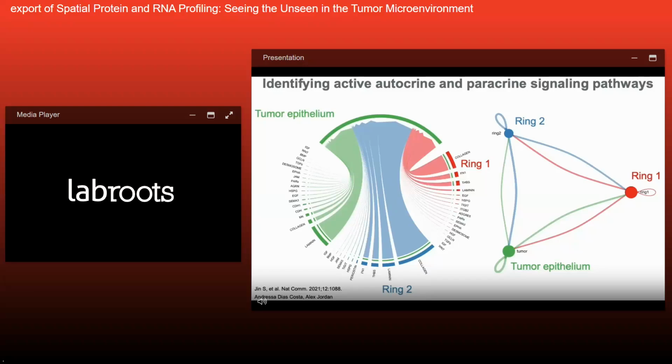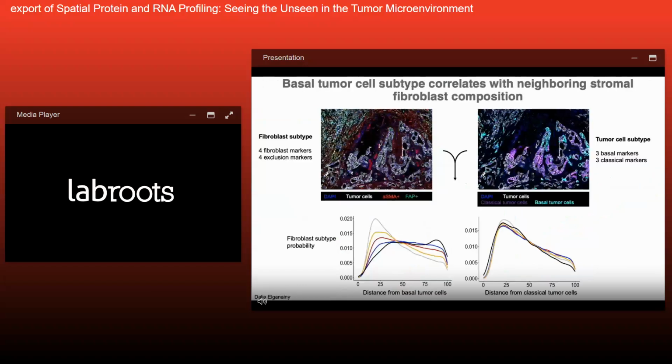And doing these types of analyses and others then allow us to understand how these cells are actually interacting, and for example, in the vitamin D trial, which cells might be primarily responsible for sensing a vitamin D signal that then might be causing secondary effects in other portions of the tumor microenvironment. And based on these analyses and other observations that we've made, we've started really delving into how the tumor cells in the microenvironment are interacting with the surrounding fibroblasts to set up the organization of fibroblasts in pancreatic cancer.